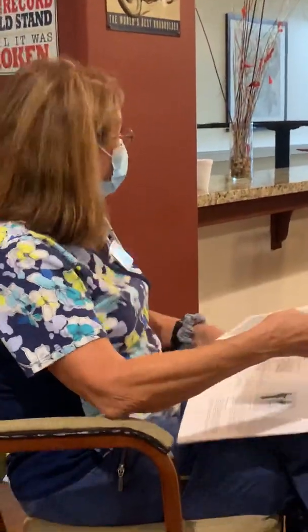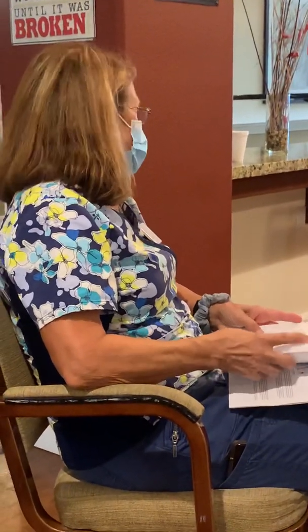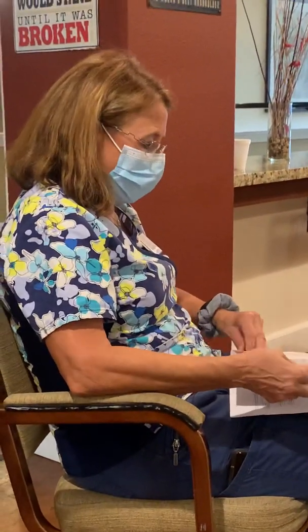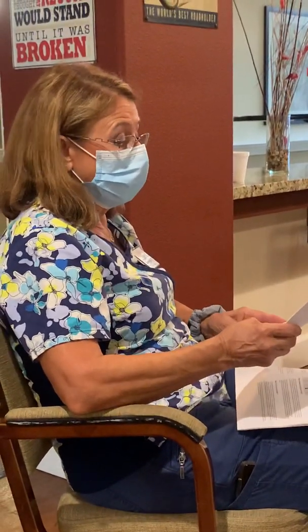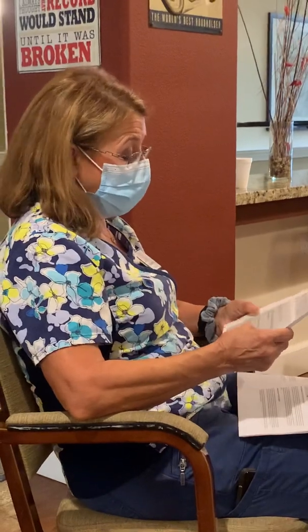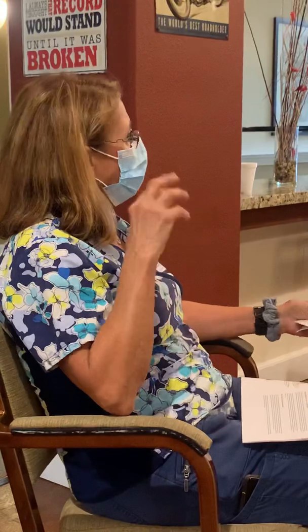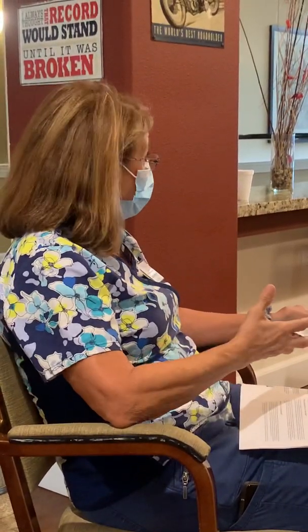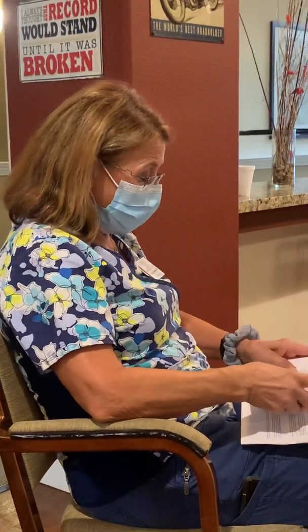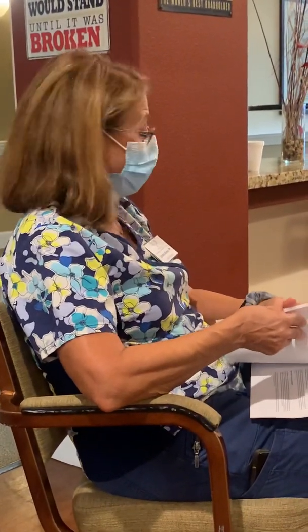Just straight Foley care, as well as watching for Foley infections, urinary tract infections. And then it says here, catheter-associated urinary tract infections. They're the most common type of hospital-acquired infections. And even though it is a hospital, we still have to make sure that we maintain that cleanliness here, and we don't want them to get an infection here in this building. And of course, their biggest risk factor is prolonged urinary Foley catheter use.